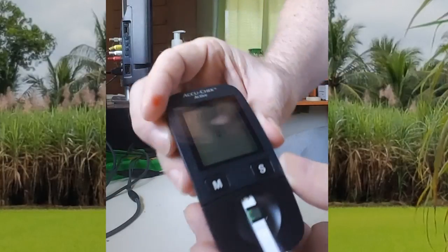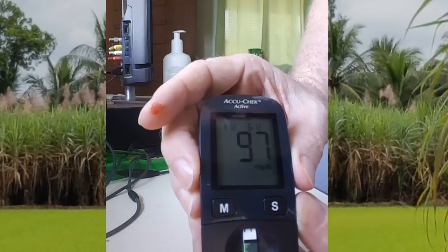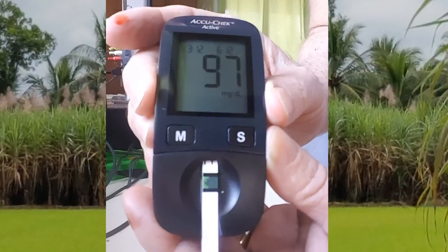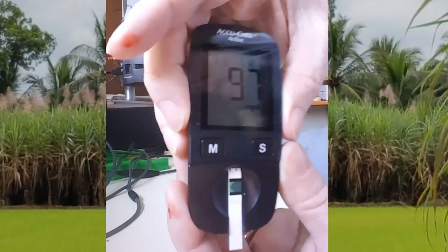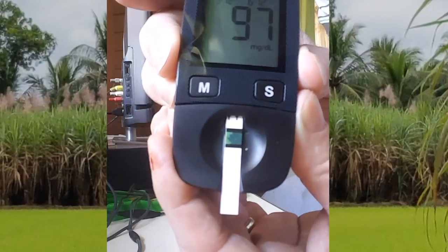I put the strip in and now I'm putting my blood on the green part. It's reading. My blood sugar 15 minutes after drinking 13 ounces of sugar cane juice is 97.